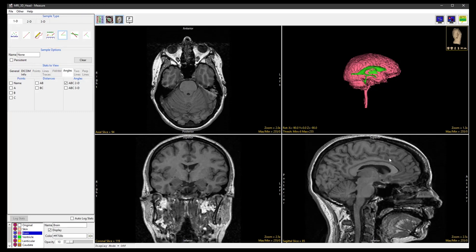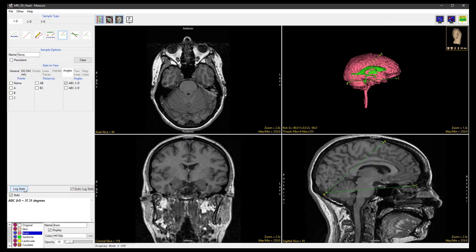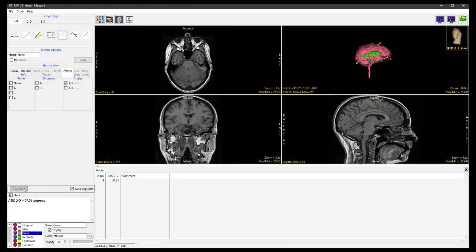Then on the Sagittal Display, define an angle by clicking three points A, B and C. The angle measurement will be displayed in the Stats Review area. Now check the Auto Log Stats checkbox and click the Log Stats button. The angle measurement will also appear on the Stats Log.